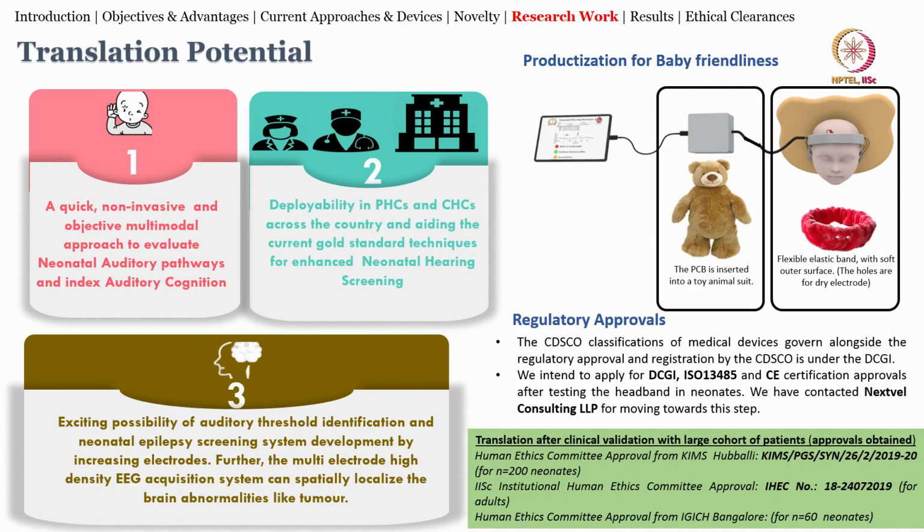None of the technology that I teach you has anything to do with removing or replacing a clinician. We should not be replacing the clinician, we should aid them, help them, and empower semi-skilled personnel like ASHA workers, so that they can use this technology. Where clinicians cannot be reached, and where the existing costly technology, 14 lakh, 15 lakh, cannot be commissioned or placed, in those cases we can use our technology, which is much more affordable, can be easily used, and can be used for screening neonates who are right now not screened at all.